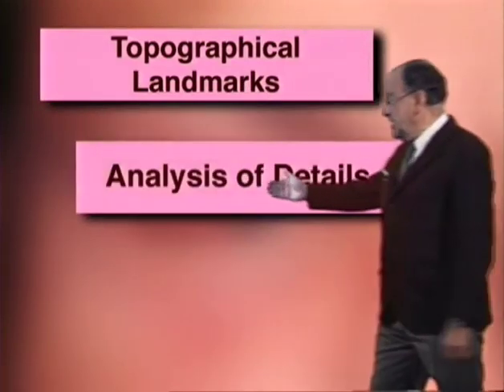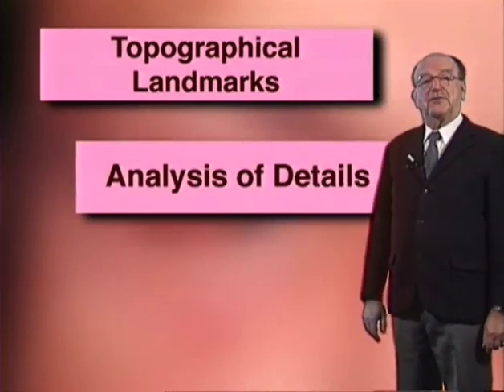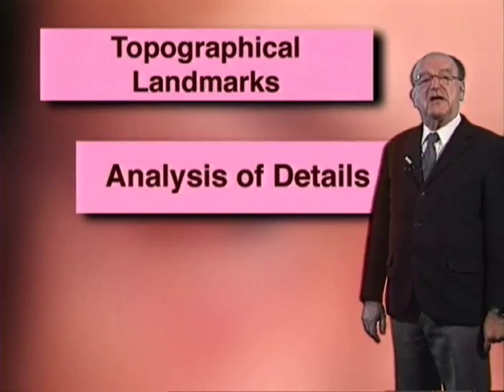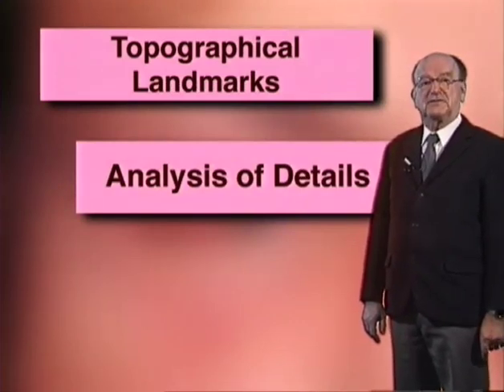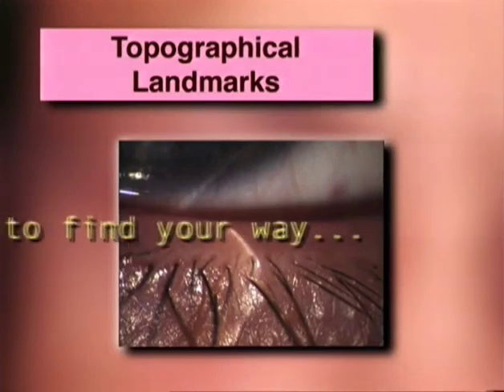And the second chapter, entitled Analysis of Details, will draw your attention to minute details which are relevant for the windscreen wiper function of the lids. How to find your way within the microanatomy of the lids.